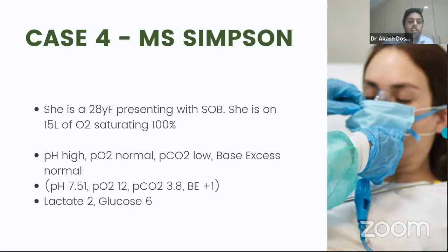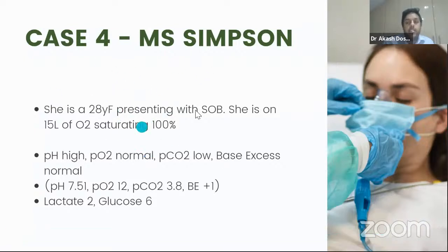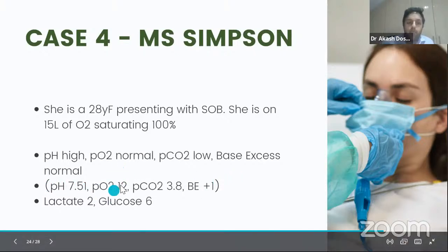Even though the gas looks relatively fine, one would almost say, oh, this is not at all concerning, their parameters are quite fine. This is why the clinical context is so important, because with this clinical context, that gas is terrible. Only one thing is properly wrong with it, although this and this are slightly abnormal. But this is the thing that's really worrying and of concern.